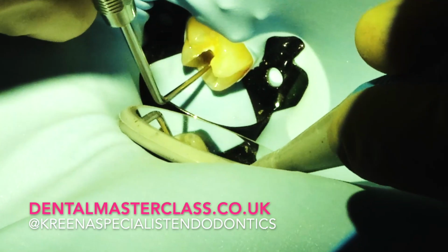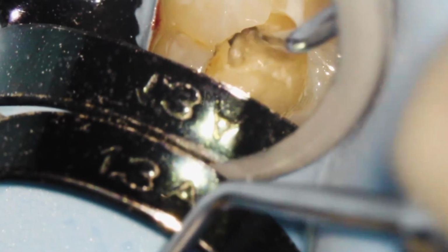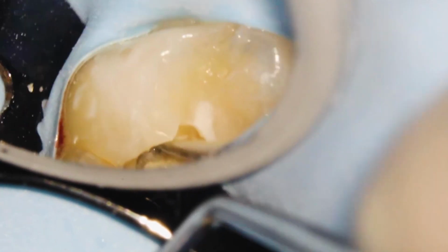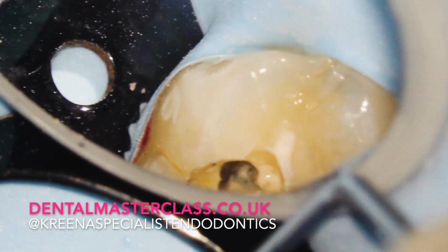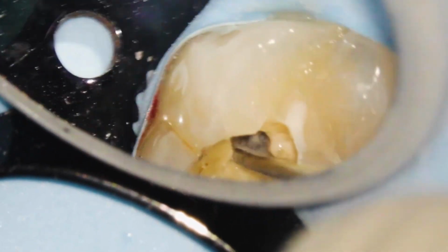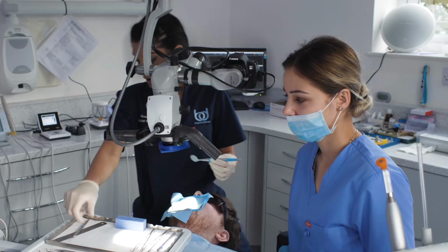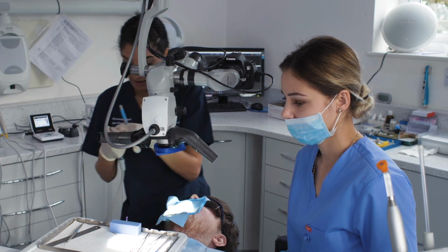So if we have a look here, I've just removed the caries and we can see that there's been an exposure of the pulp here. So I'm just going to enlarge this access now. I'm using a DG16 probe, which is a lot sharper and a lot longer. So it's very good for detecting canal orifices and also just dropping into the pulp chamber. I'm now switching to an Endo Z burr, which is a non-end cutting burr.